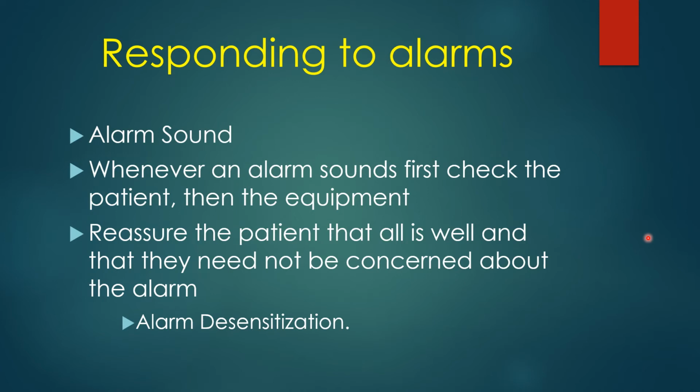But especially if you have a patient who's deteriorating, you want to take the patient off the ventilator and bag them. And when you take your licensure exam next year, that question is going to be on there. You're going to have a patient who is on the ventilator, the alarms are going off, and his blood pressure is going down. And the correct answer is you take the patient off the ventilator and bag the patient.